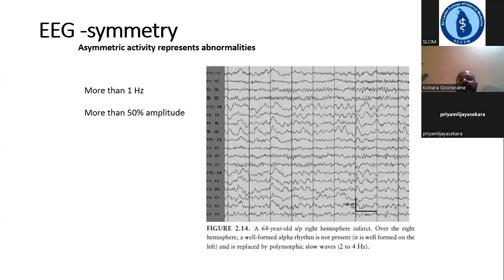So there might be excess frequency that we see on the EEG. Without the knowledge that the patient is on this particular drug, we might erroneously diagnose this patient as having, say, a beta coma or beta frequency coma, right? So the diagnosis again is contextual. So you don't need to alter medications, but maybe you need to mention in your request form that this patient is on these particular drugs, which can sometimes alter the EEG and alter the interpretation.